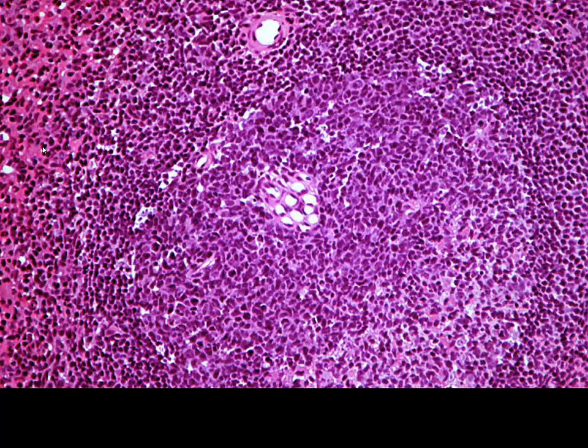Here's another view showing our white pulp, and this is a little bit different because this will be our central arteriole, but then here you see these smaller vessels sort of clustered together. These are some of our penicillar arterioles. And this location is a little bit tricky because you can see it within this secondary lymphoid nodule. So we've got the PALS here. We've still got some PALS here, but this is in our white pulp before we get out into the marginal zone and our red pulp here.